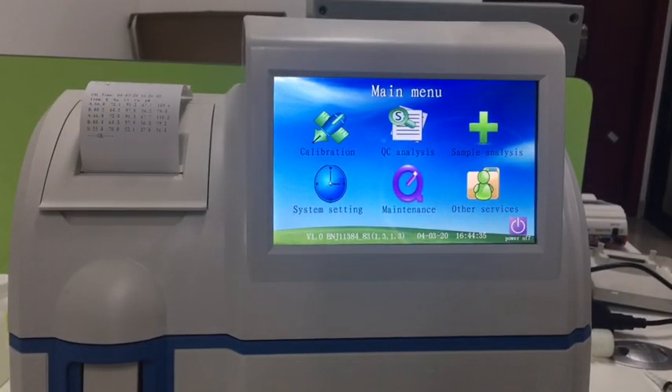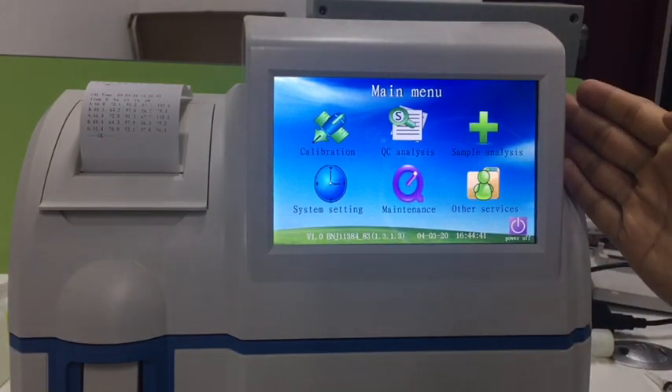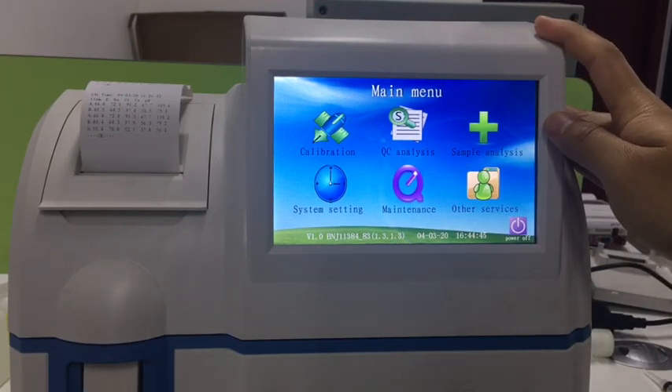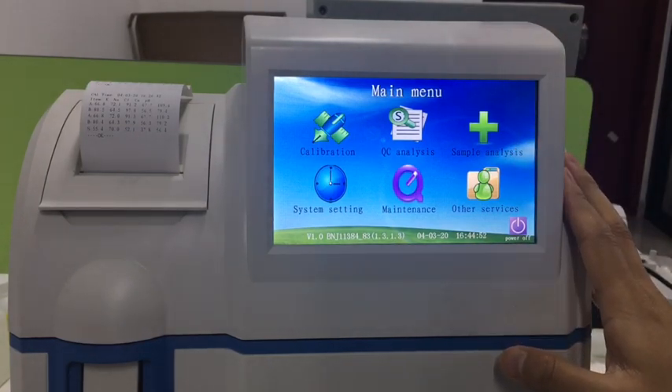This is the main menu of the electro analyzer. It shows the most common operations you need. The first one is sample analysis, which end users need most to do tests for patients.